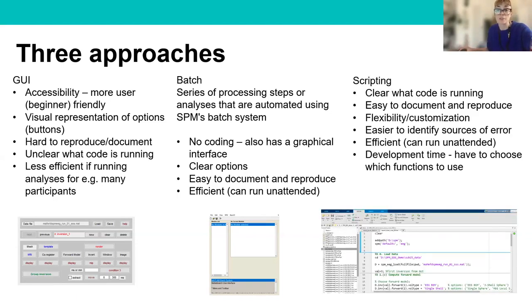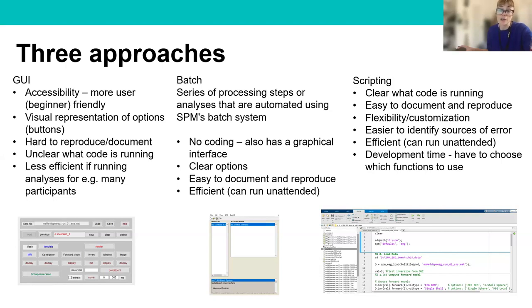The final option is scripting — writing a MATLAB script that calls the SPM functions. The advantage is that you know precisely what code is running, it's easy to document and reproduce by saving your script, it allows for a high degree of flexibility and customization, and it's relatively easy to debug. The code can run unattended, but it requires quite a lot of effort and development time to figure out which functions to use.